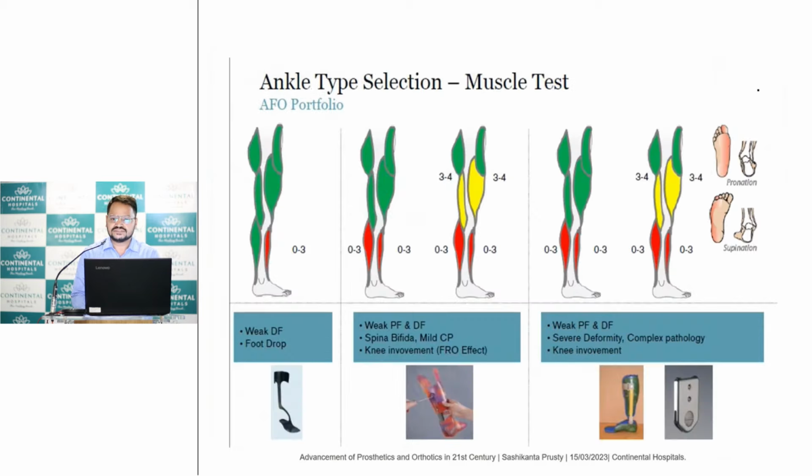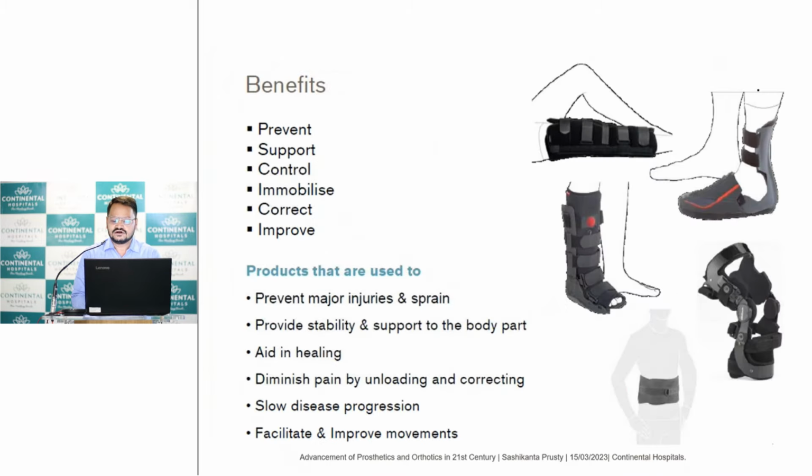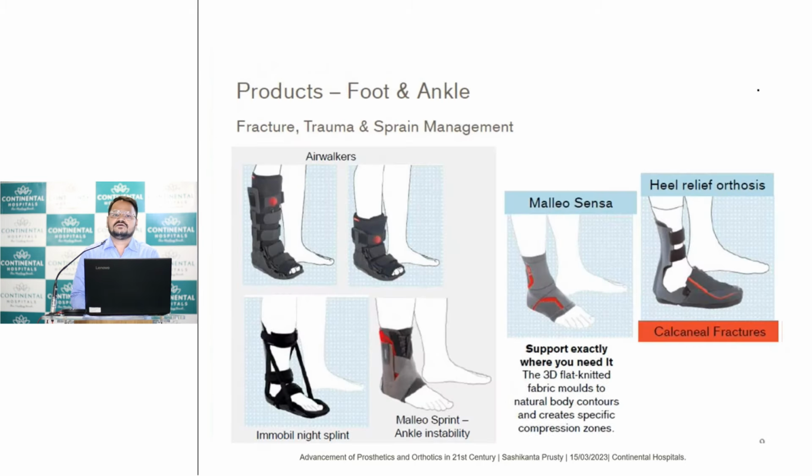Now coming to some readily available bracing that we normally put on in day-to-day life for fracture cases, post-surgical conditions, foot drop, knee pain or ligament reconstruction. There are also many spinal conditions where there will be compression of the disc in the lumbar area, or a fracture at the thoracic area. We also have specific designs related to the spine; for the very high cervical region, we can put a halo.